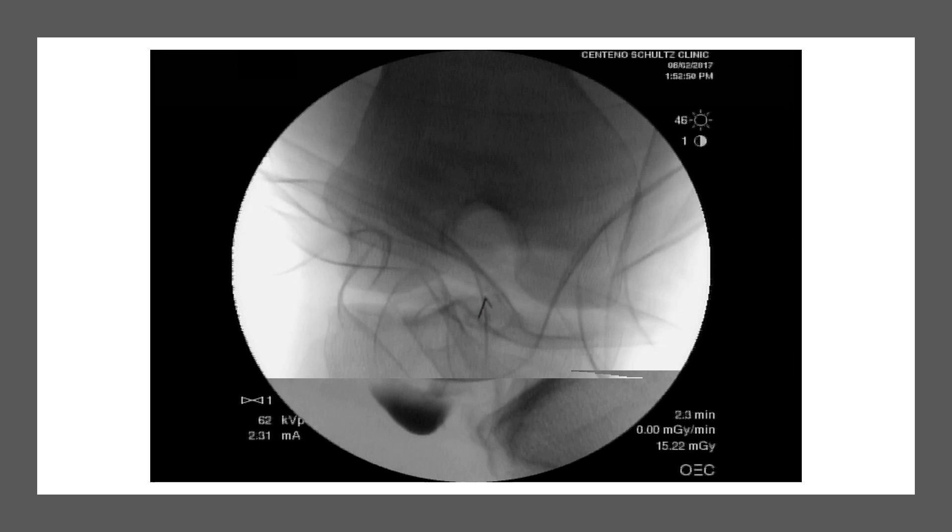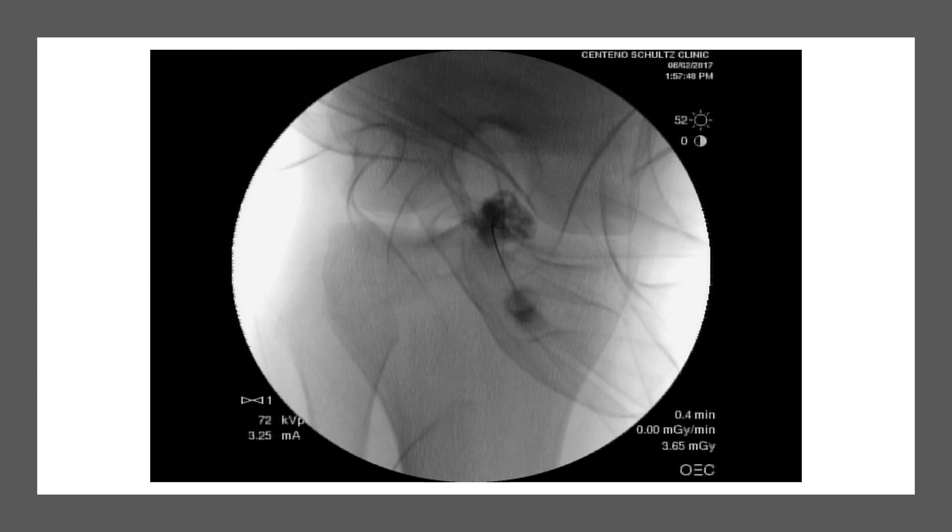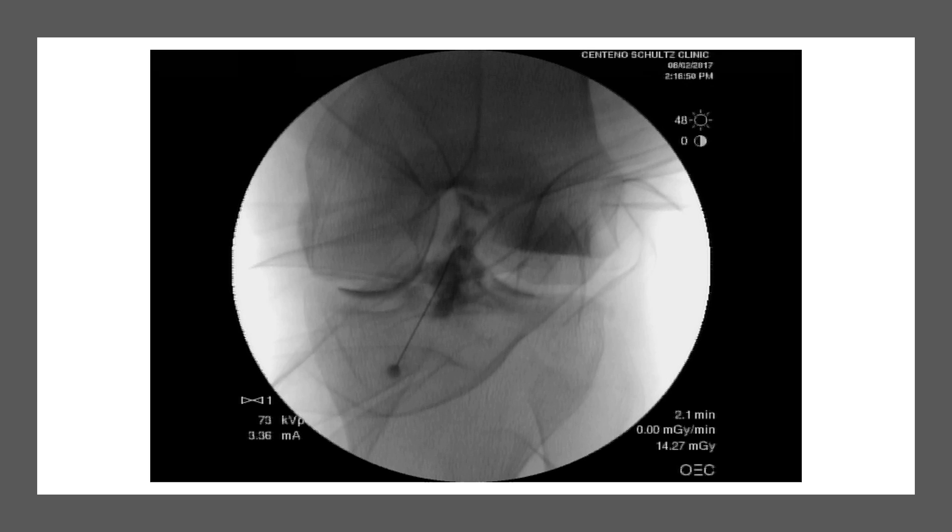Looking at it from the AP view, that's my first needle position — that's really all I can get coming from the bottom, where you would normally come from on ultrasound. Ultimately, this is what I end up with — pretty good coverage considering how torn this ligament was. But just injecting down here, or trying to come from the back, there is no way this would have been covered. This was about 25 different needle positions over a 45-minute procedure to get the coverage I got.